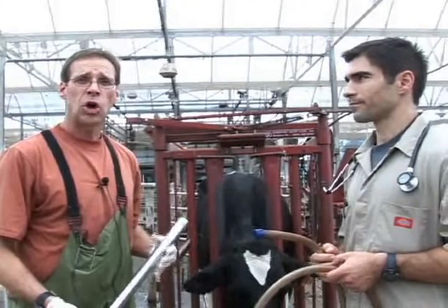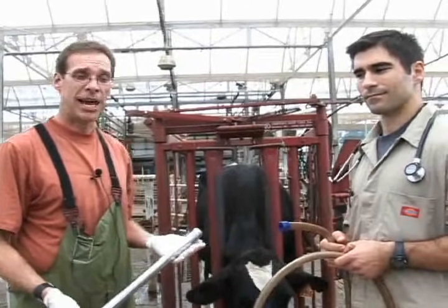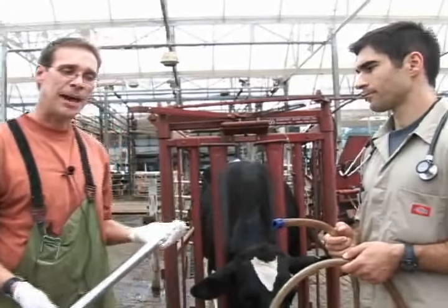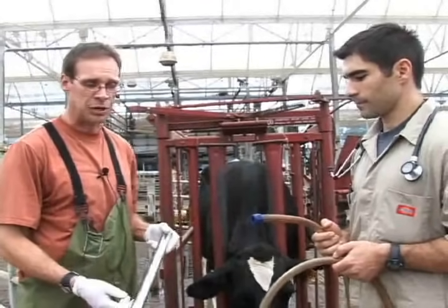Many times we have to administer large volumes of fluids, as many as 10 gallons, to these cattle to help rehydrate and supply certain electrolytes. In order to get that procedure done, we actually have a different setup. This setup involves three components.